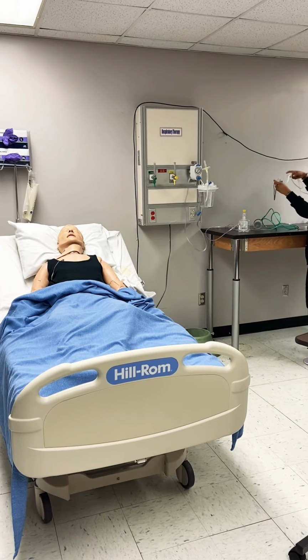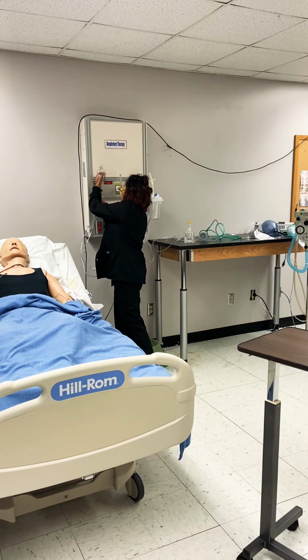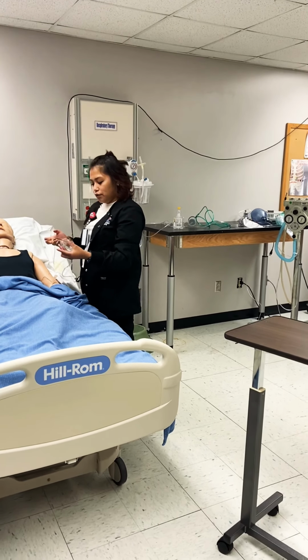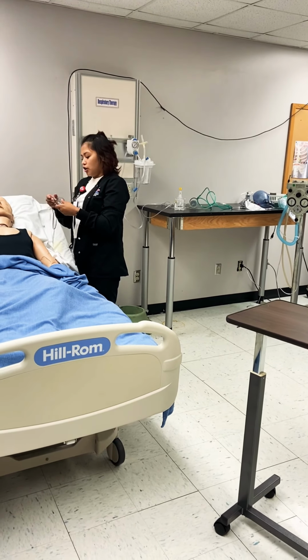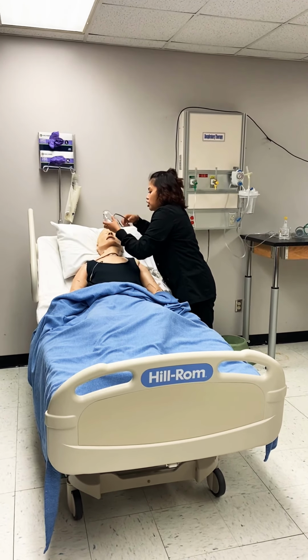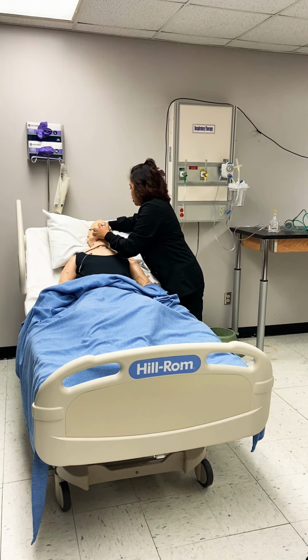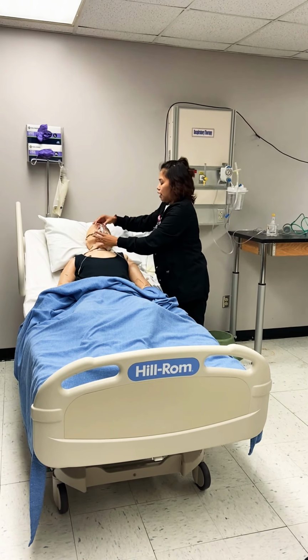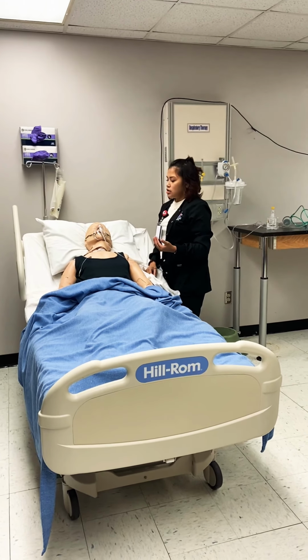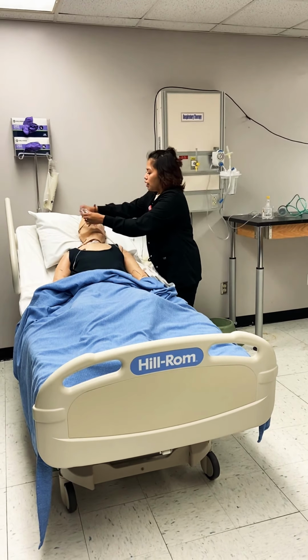So the next device is a simple mask. The simple mask is used with liters of greater than 5. So you connect it into the Christmas tree, and you never use a bubbler. The FiO2 is 35 to 50%. So when you put it on the patient, you want to make sure that it's like that and like that. An advantage, it's easy to use, it's disposable. And a disadvantage is it can be uncomfortable, and then you have to actually remove it when a patient is eating.